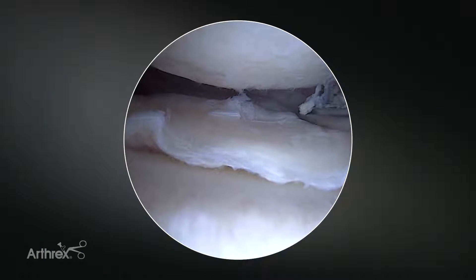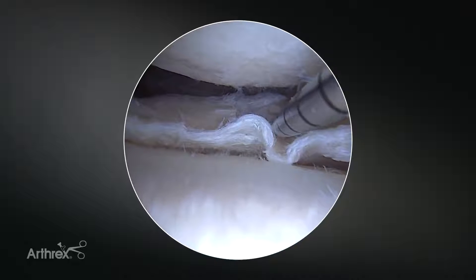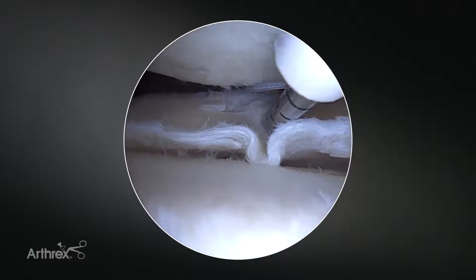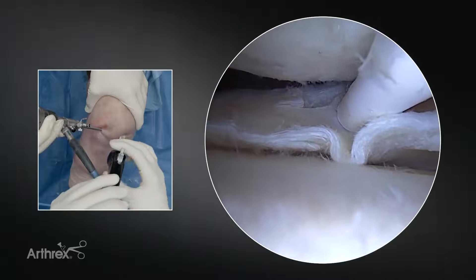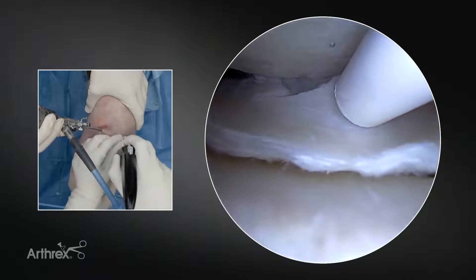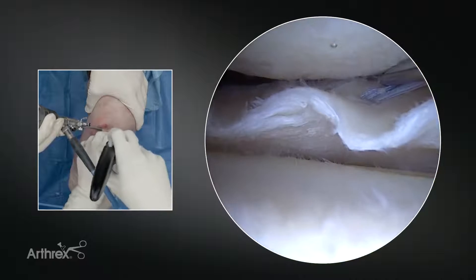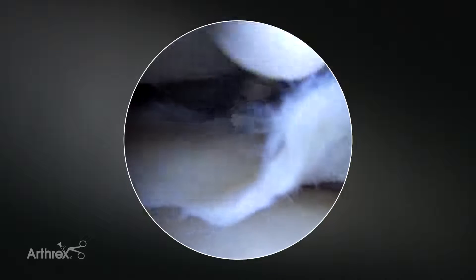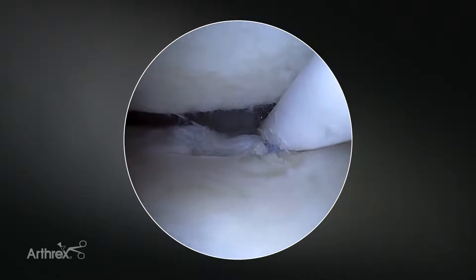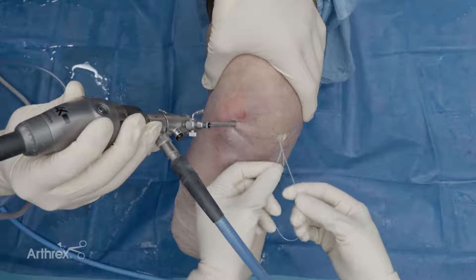We can go first either on the capsular side or on the meniscal side. I'll start in the meniscus here, puncture through the meniscus, and then reduce the tear. Go through the capsule, deploy the first implant, pull back, and then we'll travel up to the capsular side, deploy the second, and then pull out. What you'll see here is the loop and the second stitch.